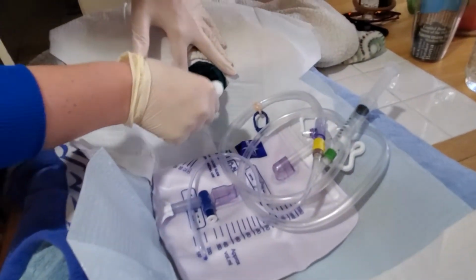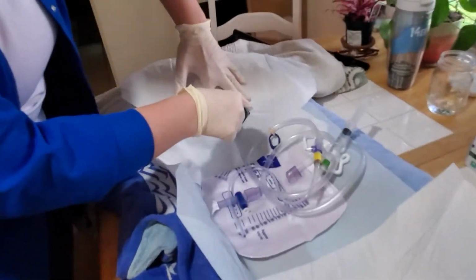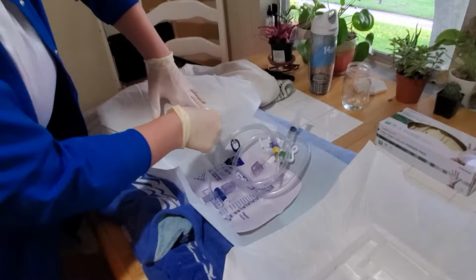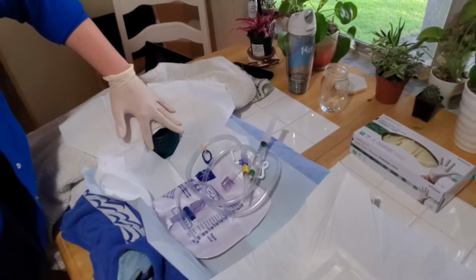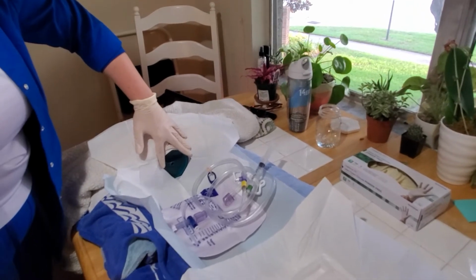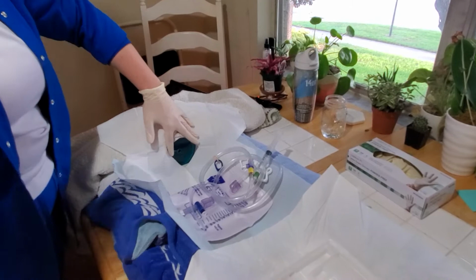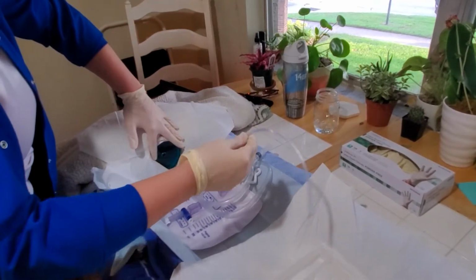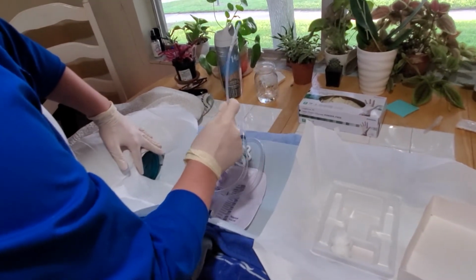The outside down. And on the other side. And the other side. And now I will be dropping my forceps along with that. And now I'm going to be asking Anna if she could please bear down for me while I insert the catheter with my dominant sterile hand. A few inches away from the tip.